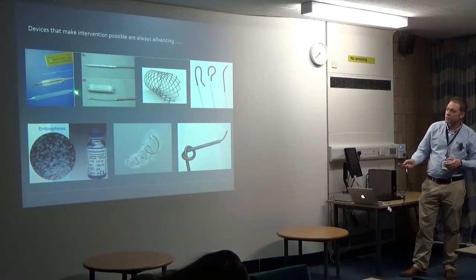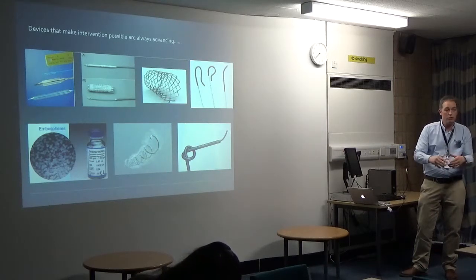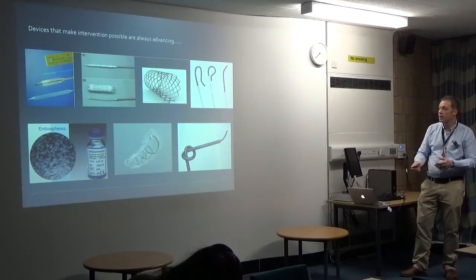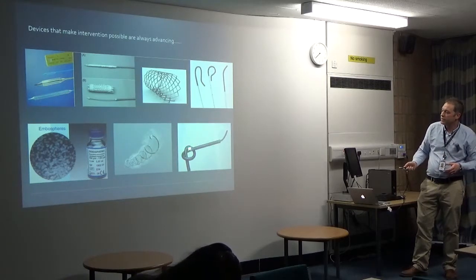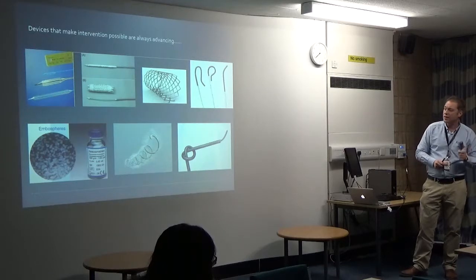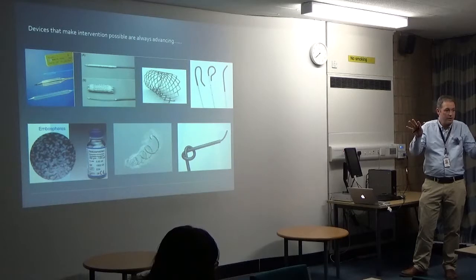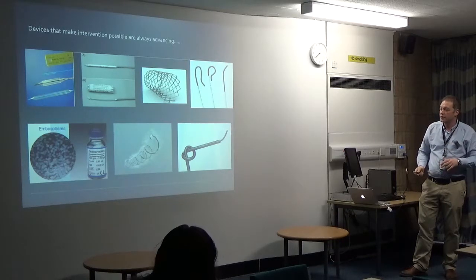We've got stents that we can use that hold open either bile ducts that are narrowed or blood vessels that are narrowed or blocked. We have all these different fancy catheters. I use one frequently for the liver treatments that's 0.6 of a millimeter wide. You know, it's absolutely tiny, this thing, and you can get it right out into vessels 1 millimeter in diameter, right out in the liver. It's fantastic kit that we've got these days.